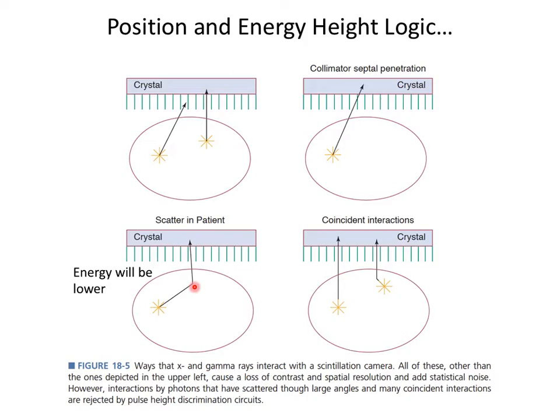So no filtering of anything, right? It's just hitting this thing, and the signal you get is a photopeak and then a big set of stuff down here that is from these interactions, scattering events. What we're interested in is this signal here, which is photons that are coming just out of the patient and hitting the detector.